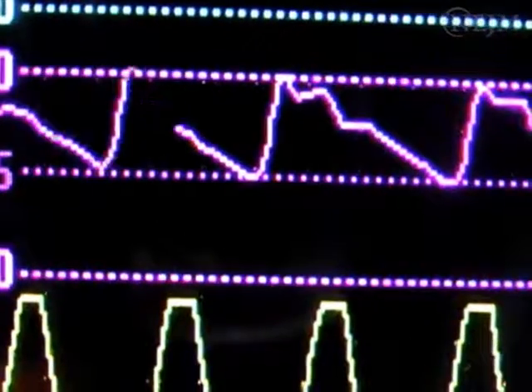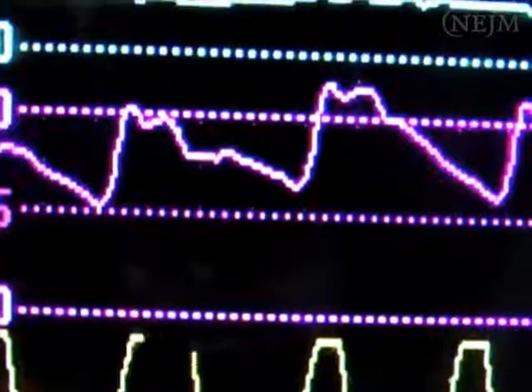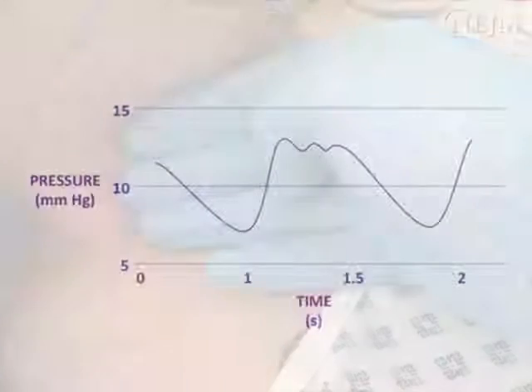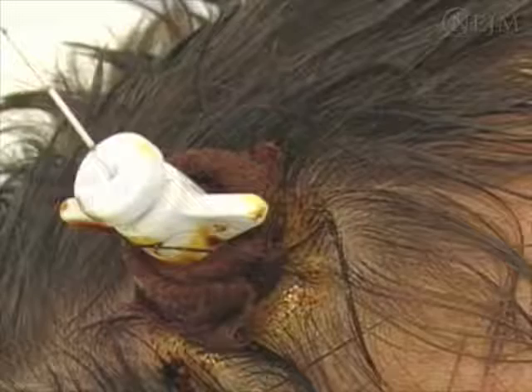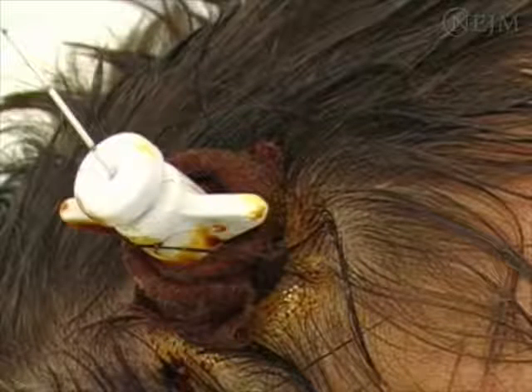Normal intracranial pressure is 7–15 mmHg, with an upper limit of 20 mmHg. Gentle pressure over the jugular veins should cause a rise in intracranial pressure; the rate at which it rises may indicate the degree of compliance of the brain. If there is no increase in intracranial pressure, check the waveform. An ICP waveform consists of several peaks — P1, P2, and P3 — which may be considered the combination of arterial and other waveforms. If the waveform is absent, check the ICP sensor and transducer, as technical malfunction or loss of calibration can lead to inaccurate readings. For cases where the intracranial pressure is no longer consistent with clinical and radiologic findings, the ICP sensor may need to be replaced.